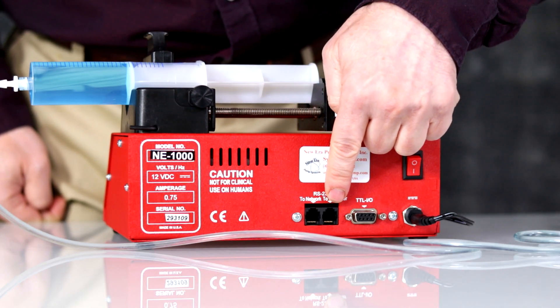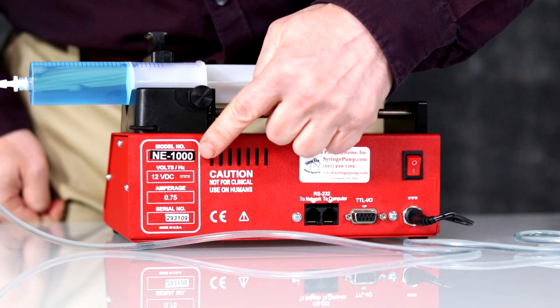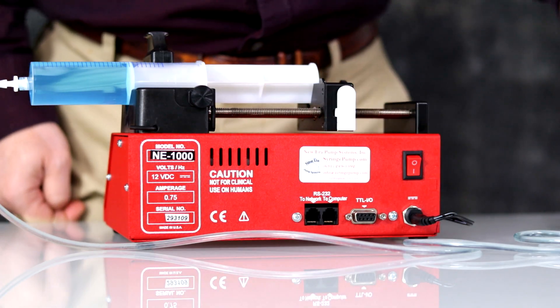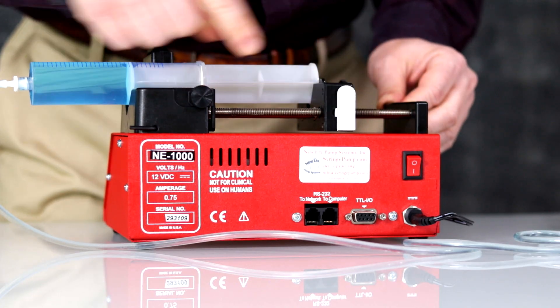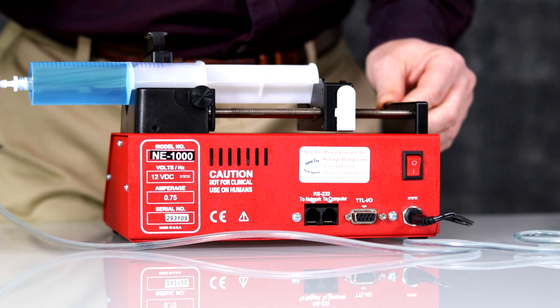This is for the PC, this is for the network. This is the model information, model number, serial number. This is the drive nut block for removing the pusher block. This is the Allen wrench for removing the collar clamp.